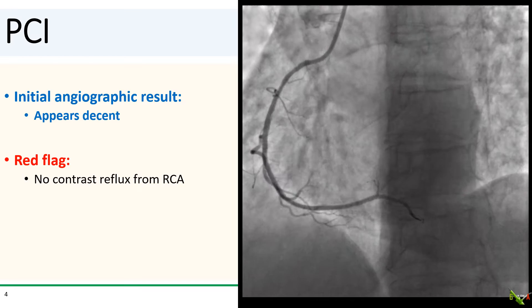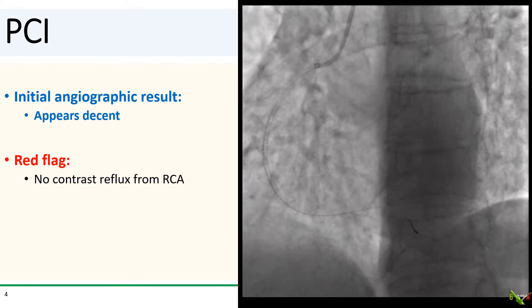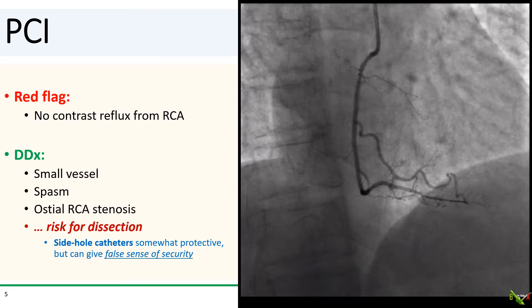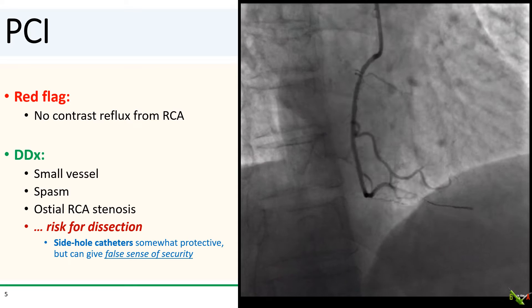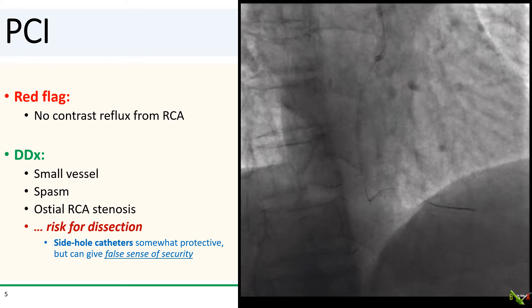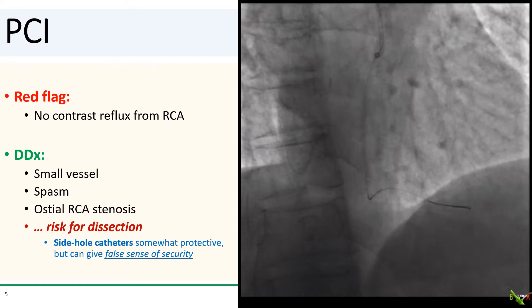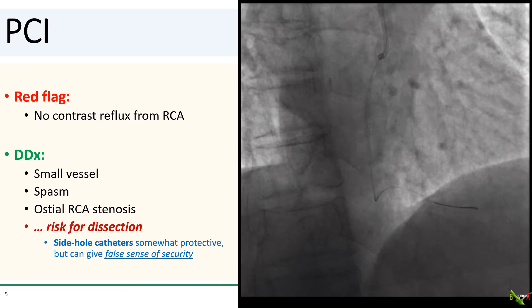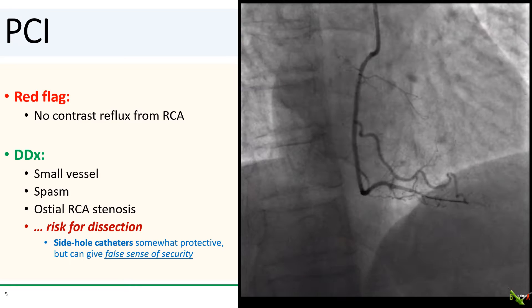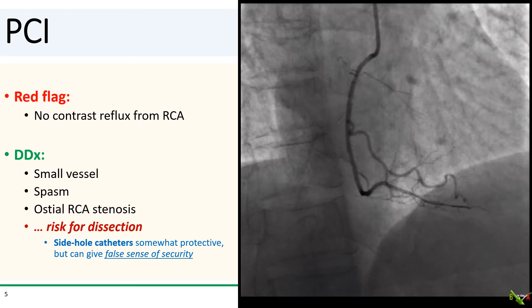But there is one red flag on this angio: there was no contrast reflux from the ostium of the RCA. You can see the lack of reflux better from this view. So what's the differential here? Well, first, it could be that the RCA is just a small vessel that barely accommodates the guide catheter. Second, it could be ostial vasospasm. And third, there might be an ostial stenosis that perhaps we just didn't appreciate very well at first.